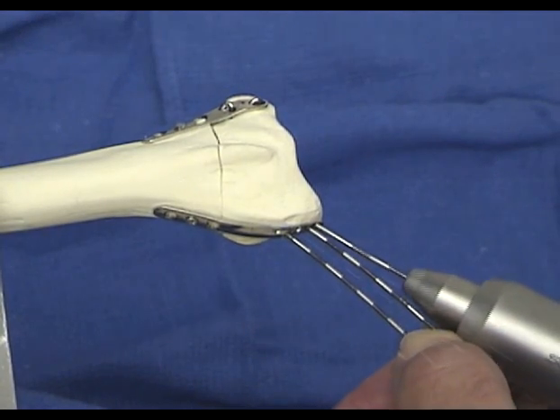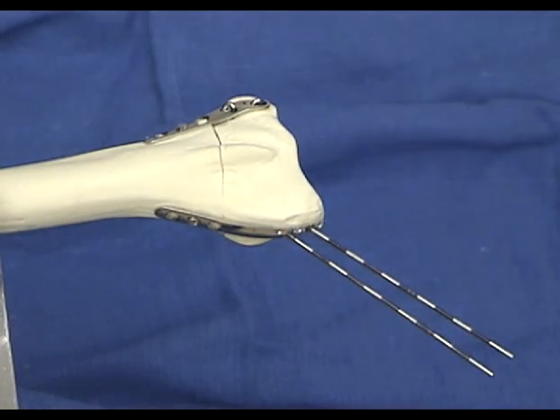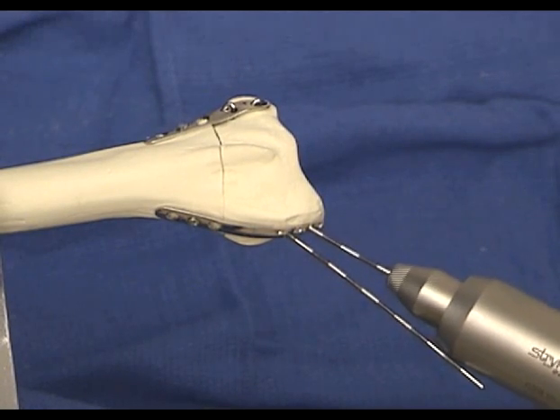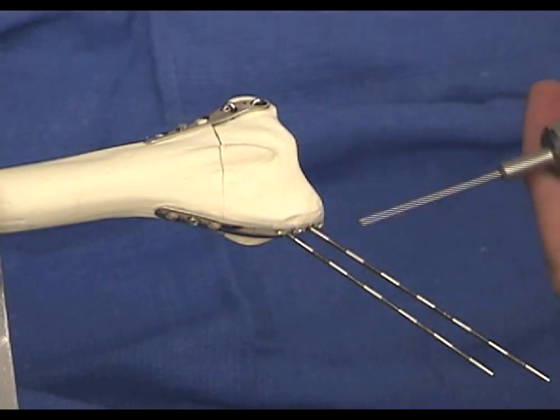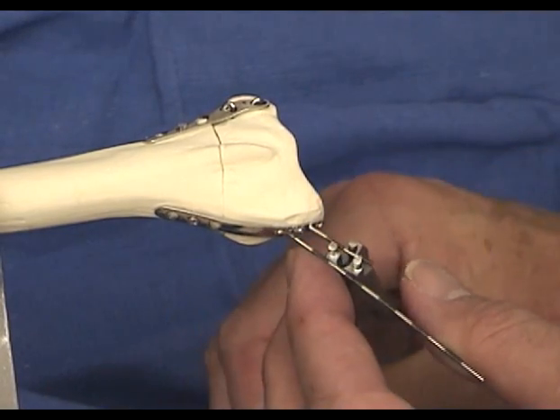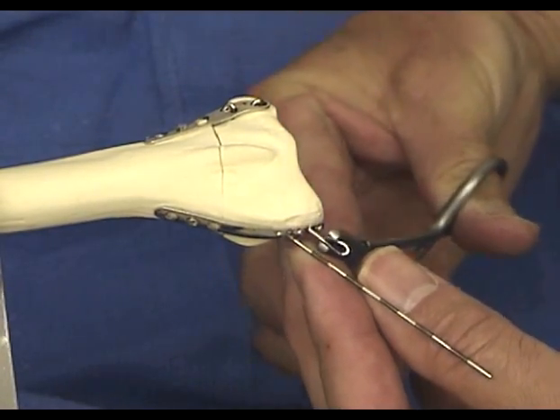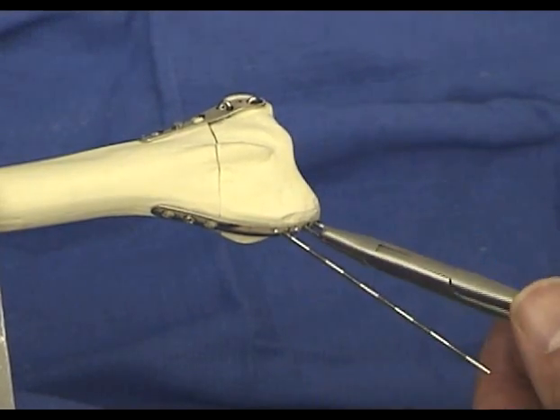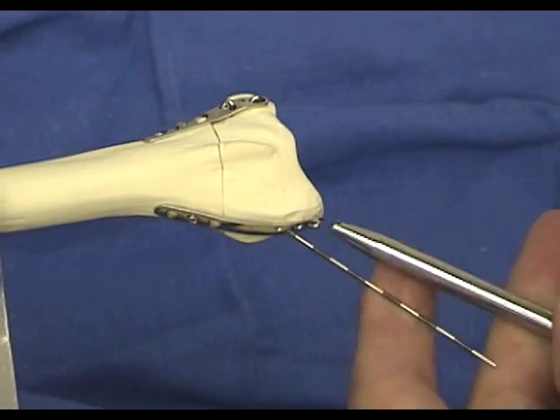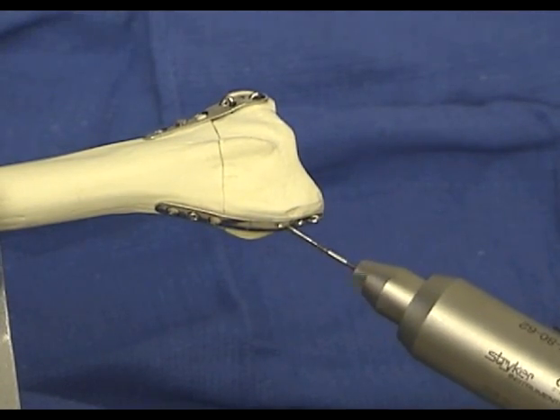Adjacent pin holes are drilled for seating of the hooks. The mark on the surface of the plate indicates the correct final length of the pin. The pin is withdrawn a pair of bands and cut a pair of bands distal to this mark. The pin bending tool is used to create the hook, placing the proper length mark between the lower two posts. A pin clamp is used to complete the hook, slightly smaller than the separation of the pin holes, to snap the hook into the plate. A pin impactor allows final seating of the hook into the plate.